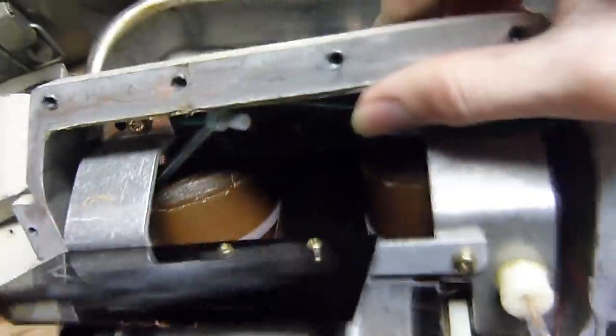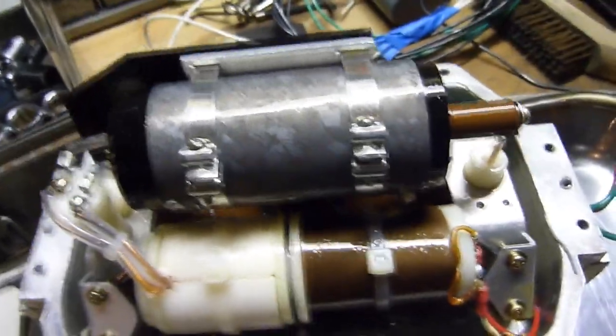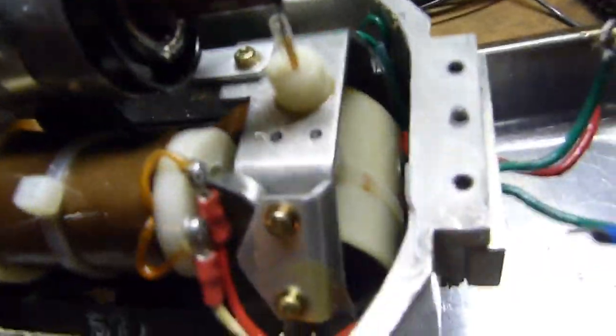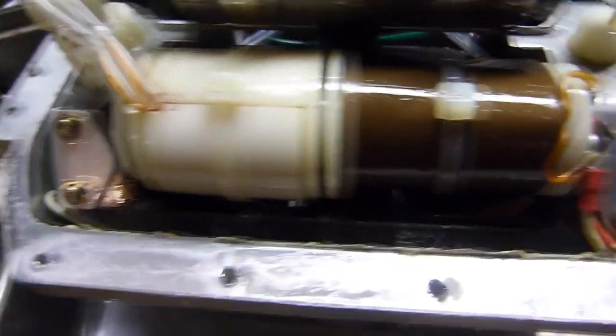Looks like we've got the transformer core in the back. The x-ray tube is right up here, and there's really not too much else to it, although it looks like it has some kind of separate little winding here.